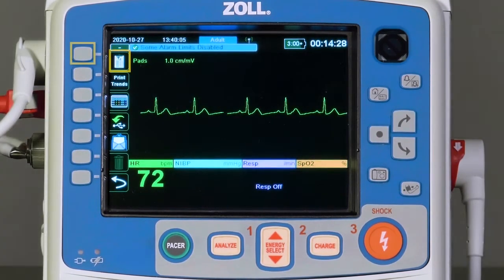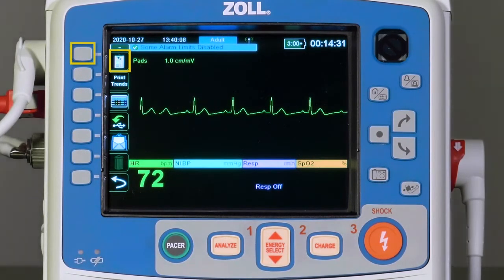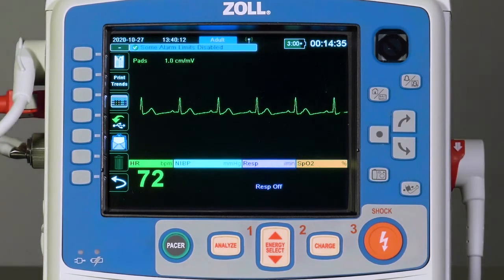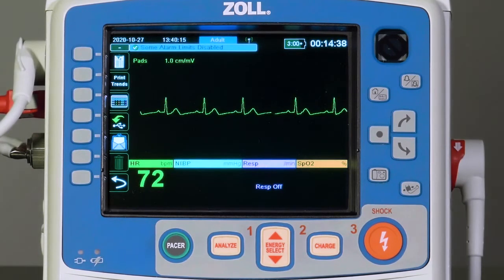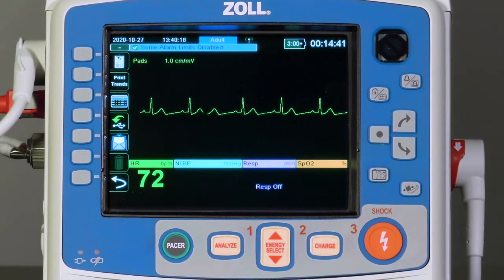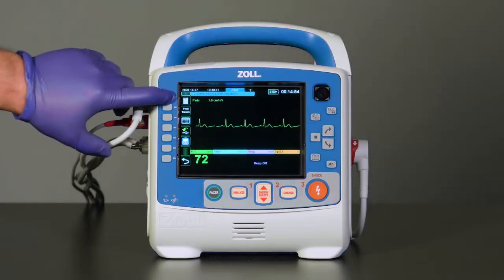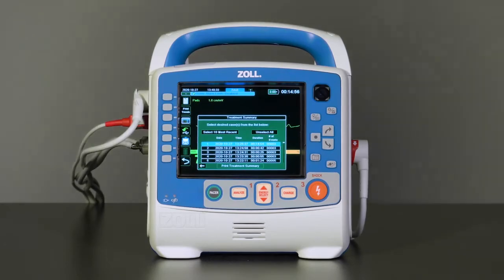The first key is Treatment Summary, where a code summary can be accessed. The summary displays all of the treatment events related to a case, such as defibrillation, pacer events, alarm events, and treatment snapshots. A list of cases in chronological order will appear.